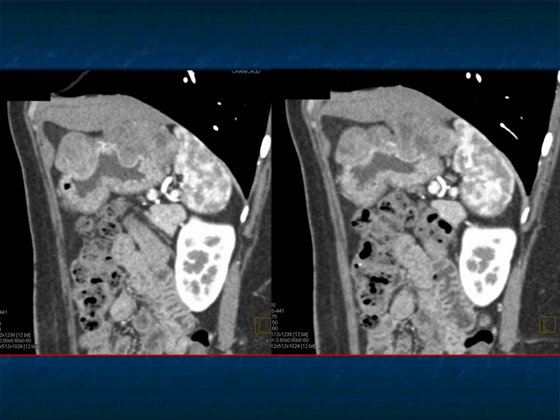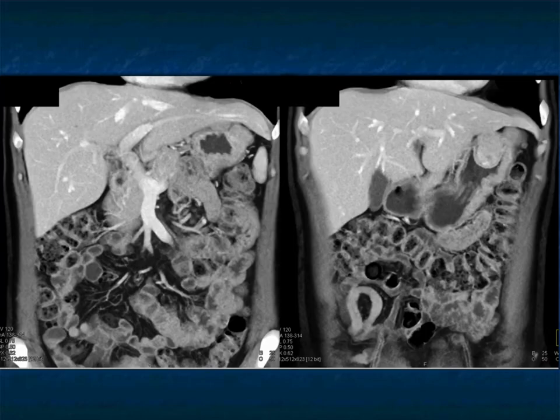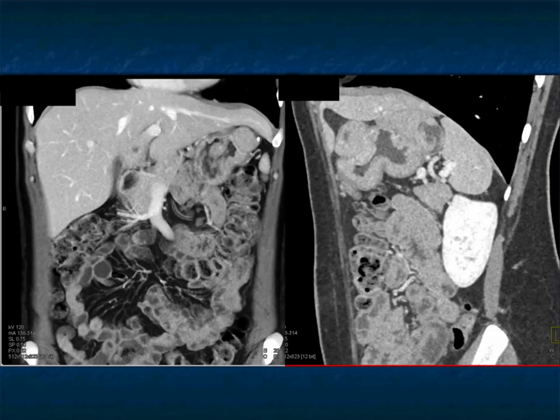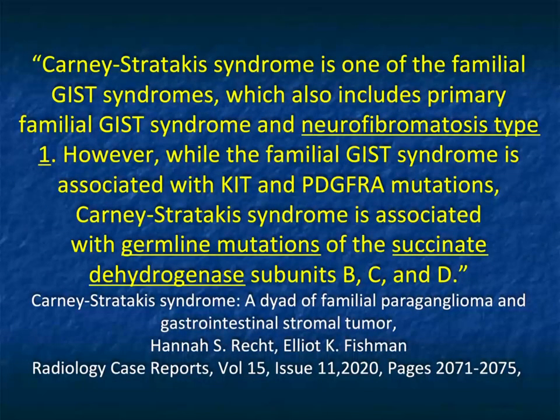Things you could think about would be polyposis — though it really doesn't look like that — or metastasis. Multiple leiomyomas might be a thought. But there aren't many things to think about for multiple solid gastric masses that look like this. This was very unusual for us — we wrote up a case report article about this patient. Here's some more 3D volume-rendered views. This was first described in 2002 — familial paragangliomas and GIST tumors. It involves germline mutations, and is one of the familial GIST tumor syndromes, which also includes primary familial GIST syndrome and neurofibromatosis type 1.